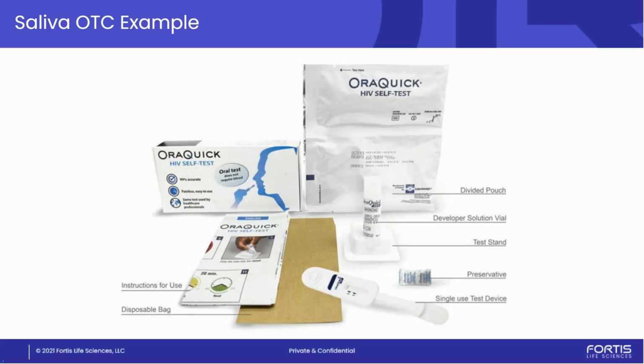And ultimately, how is that test read out? It's a visual test, and usually uses 40 nanometer gold right at that test line. But taking a step back, it's relatively simple, right? It is your saliva collection method that connects to the nitrocellulose membrane and the conjugate pad, which is in a pouch with a desiccant. So you need a Mylar pouch, a desiccant, either combined or separated saliva collection device and the test cartridge, usually an extraction buffer.